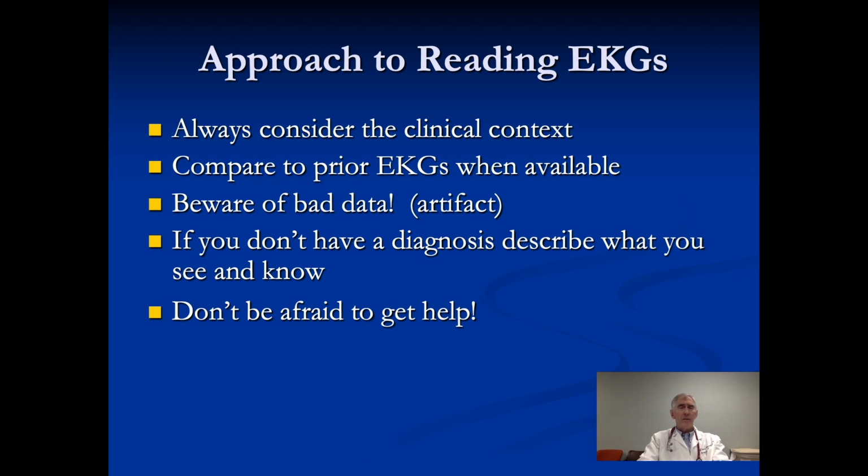Fourth commandment, beware of bad data or artifact or misplacement of leads. If you don't have a diagnosis, remember that you can describe what you see and know, and sometimes that's enough for a cardiologist to help you make the diagnosis. Last but not least, don't be afraid to get help. Cardiology loves medical students and is happy to help at any time.